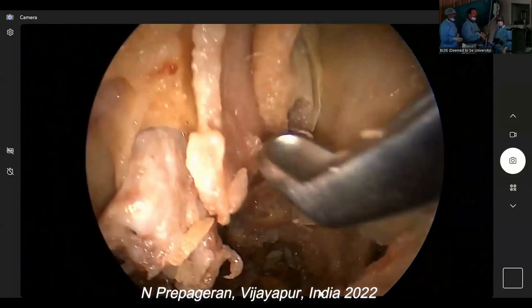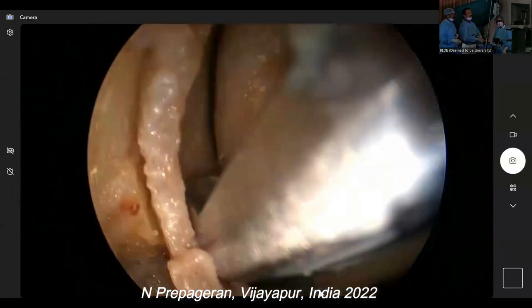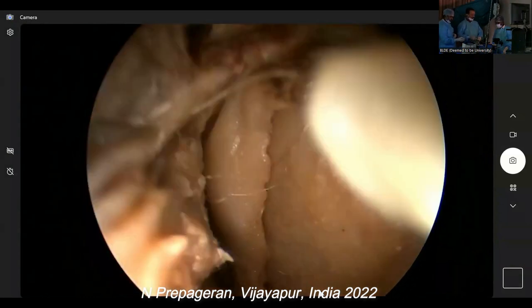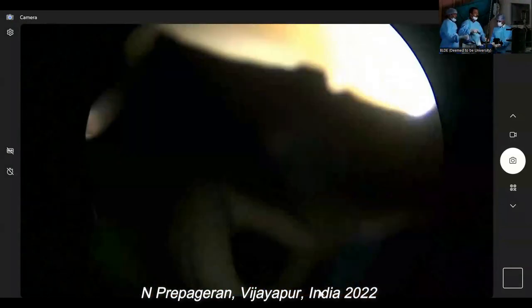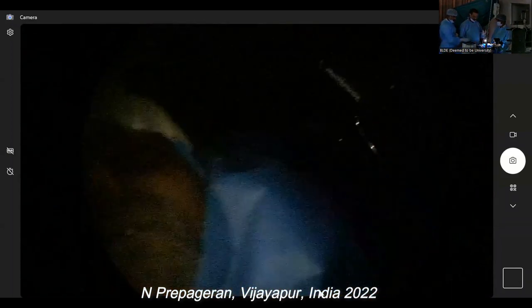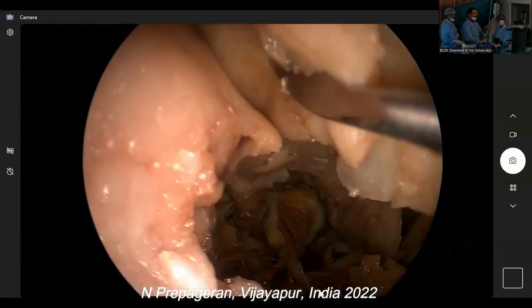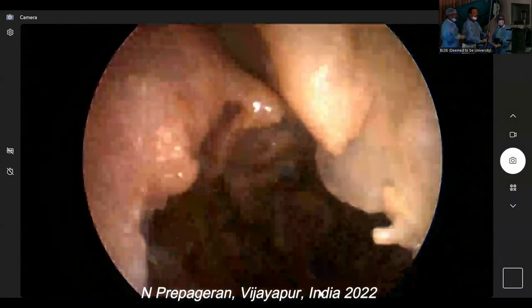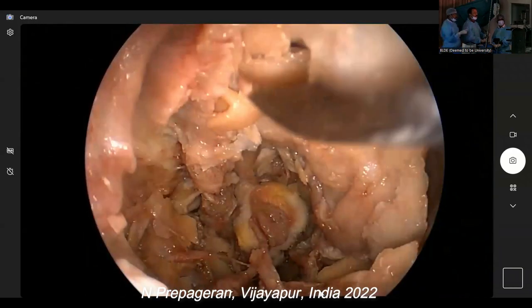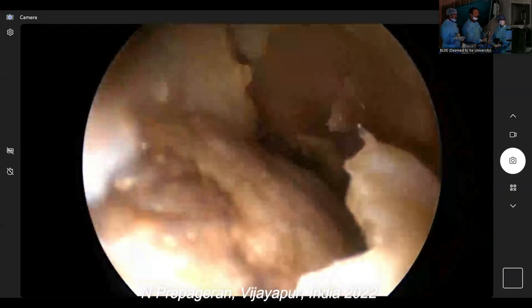So now, let's go very quickly to do our frontal. You have 45 degrees. No, it's fine. It shouldn't take long. Please, a minute. First of all, we've cut the middle turbinate. Okay, fine. No wonder we're looking for the middle turbinate. I'm going to find it. Left side is intact, so we do the left side, easier.